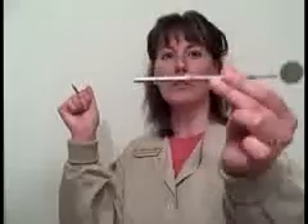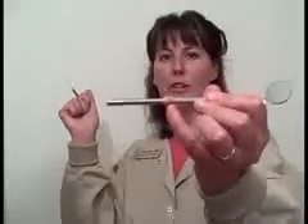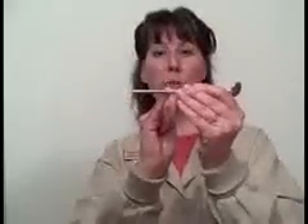So, this mirror handle — let's say now that it's a probe. I have a couple of identification bands on here, and this will represent the first marking on the probe. This area to here is three millimeters.